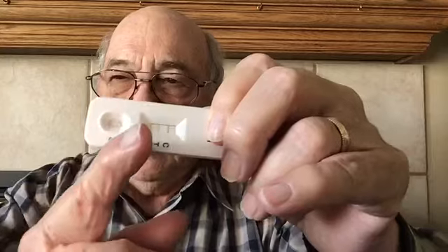Well, when you get the card out of the container, it doesn't have any lines on it. So what you do is you dissolve a little bit of the stain and drop a drop or two in this end, and then it will migrate up the paper inside, just like thin layer chromatography or any other chromatography.